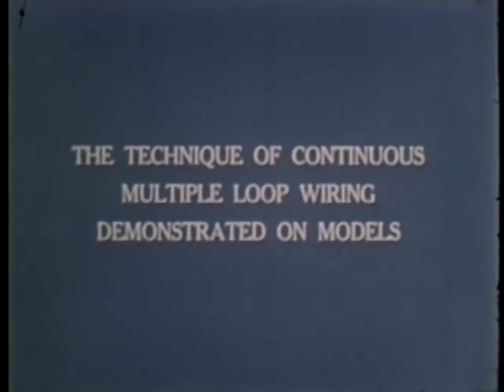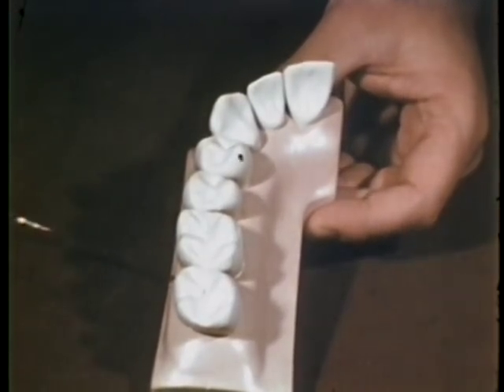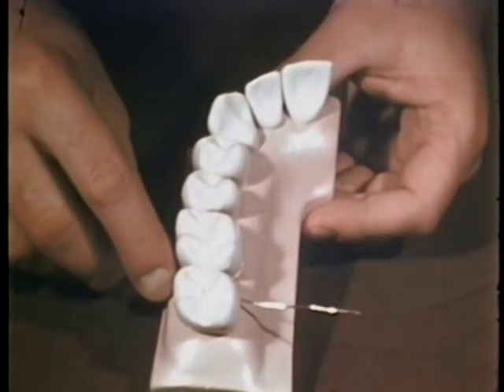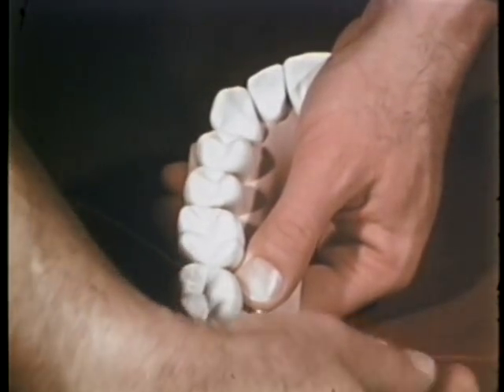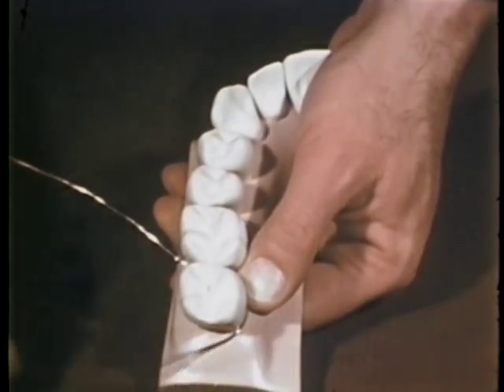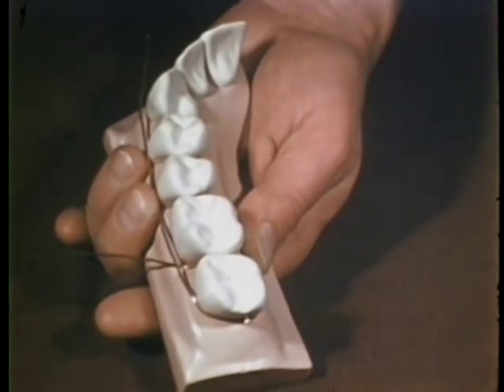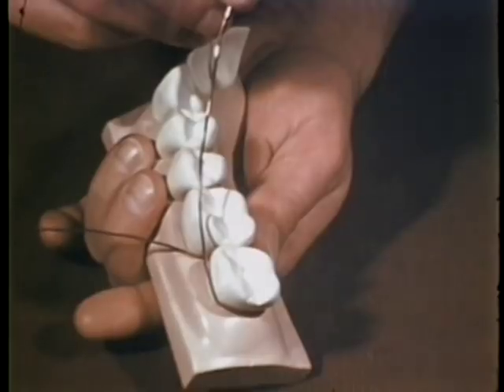The technique of applying intramaxillary multiple loop wiring is demonstrated using models and materials approximately four times the actual size. It is initiated by passing a wire of the desired length through the interproximal space from buccal to palatal. The wire is carried around the distal aspect of the second molar to the buccal surface and anteriorly, well past the last tooth to be included in the wiring — in this case the canine. This wire is referred to as the horizontal wire.